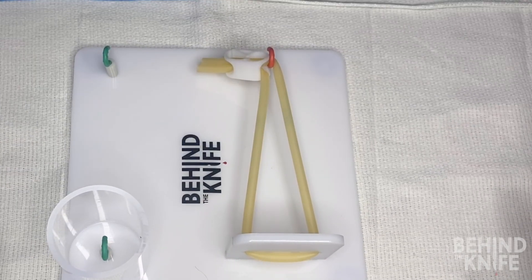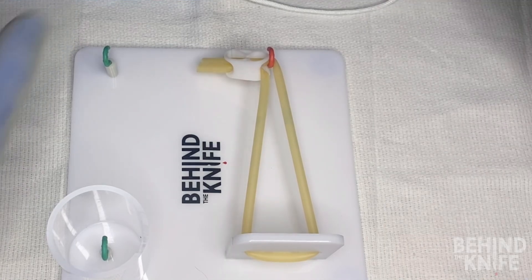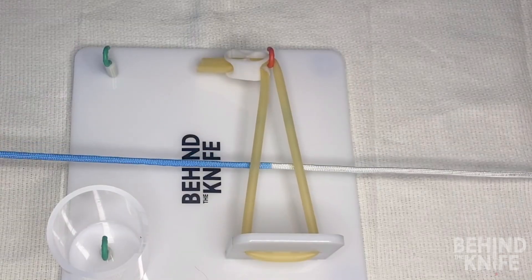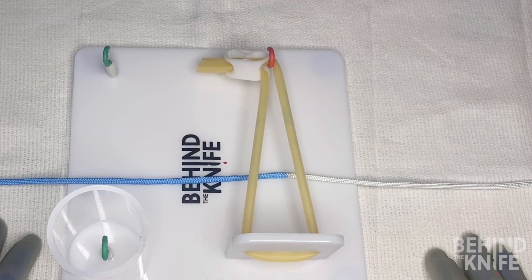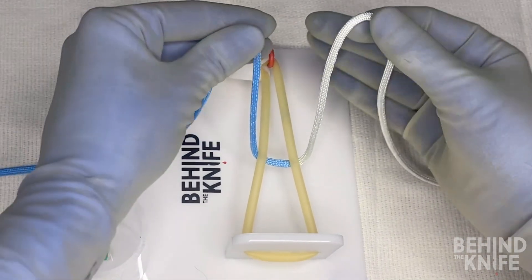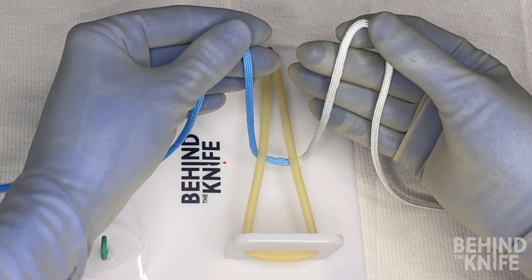To start, we'll put our knot tying board in front of us and thread our practice string behind the side that has the Penrose string. I'm going to put the blue side of my string on the left and the white side on the right. For this knot, my right hand is going to be my tying hand and my left hand is going to be my post, which means my right hand is going to be doing most of the moving.